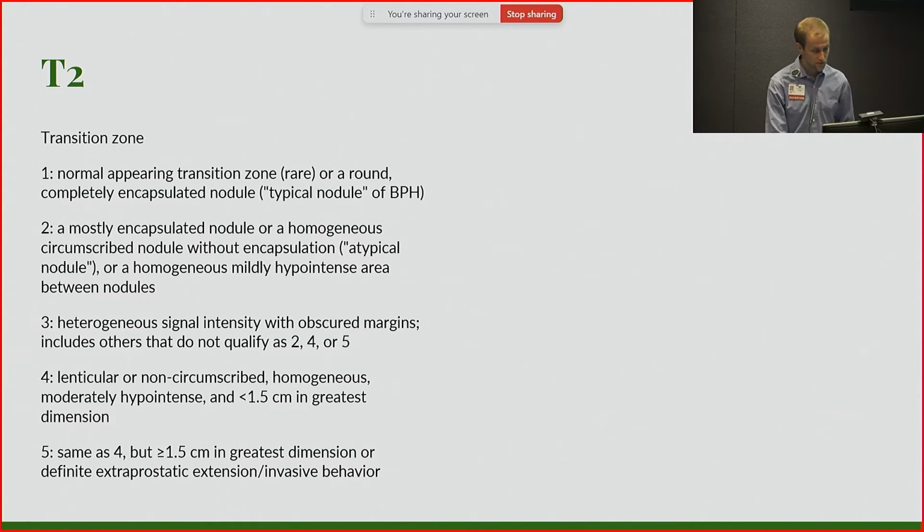So as far as the T2 imaging, these slides break all the rules of good PowerPoint presentations because it's a lot of text, and it's really just here for illustration that there's a standardized protocol for reading these scans, and it's an attempt to be pretty algorithmic: if you see this, that means that. If something is bright or dark, it means something very specific in terms of the PIRADS scale.